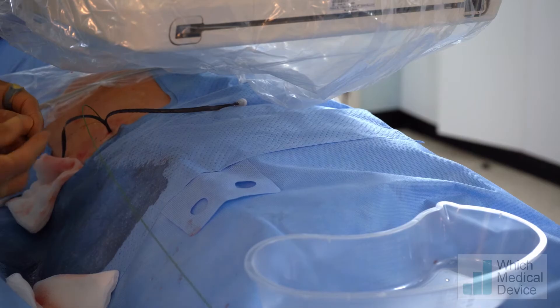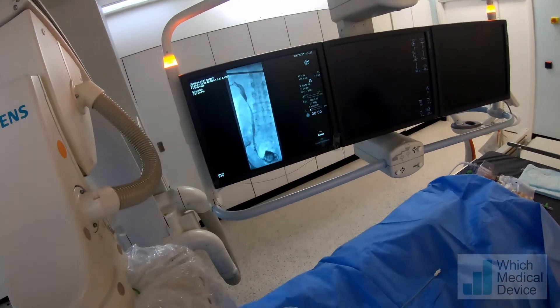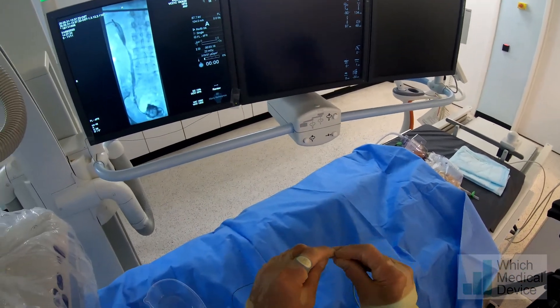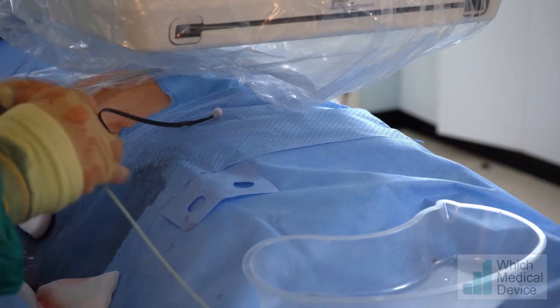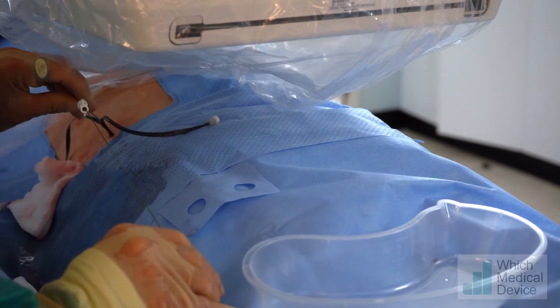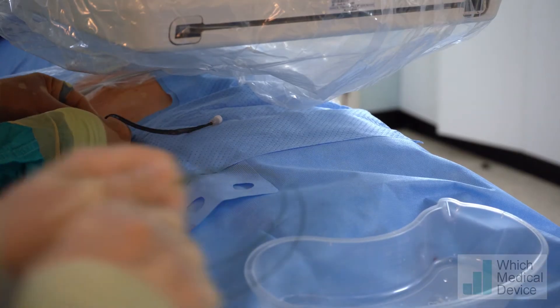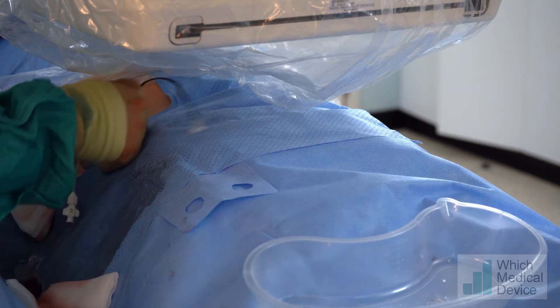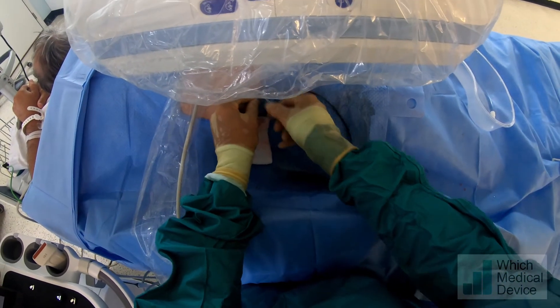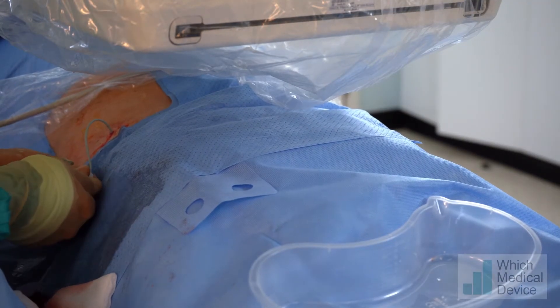You need to find the end with the knot on it and pull with that end — that pulls the thread out. The stent is still in situ. We're now going to put the nephrostomy in over the guide wire through the peel-away sheath. The nephrostomy is being left purely as a safety mechanism in case the stent doesn't do what we're hoping. This is a non-locking nephrostomy — if you left a locking pigtail, it could get caught on your stent when removed. We'll pop a bung on since the stent should be doing its job.